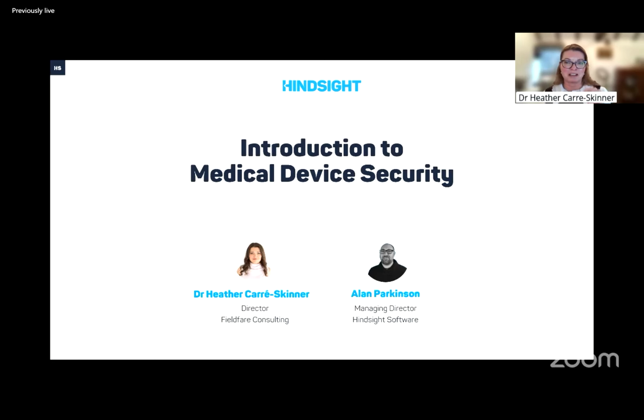I'm going to say accept to things, and suddenly you're saying yes to a ransomware attack. So I really feel like usability is also going to become such a key thing for a lot of this at-home use, when it is in the hands of a layperson, essentially.